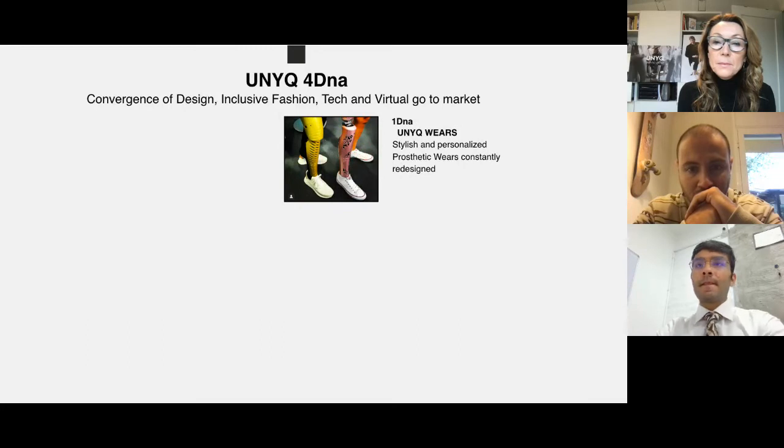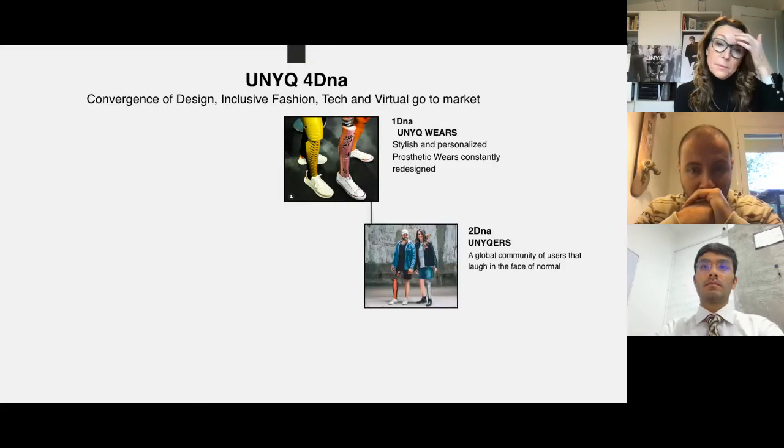And so we started with these covers, which we were able to make much cheaper than before, because the printers that we use for this have come down in price a lot, going from $5,000 down to more in the range of 1,000 and below, which is much more in the range of what insurance companies, at least in Europe and in the US, can afford. I know it's not where insurance companies are in other countries like India, but I'm very hopeful that we are steering in that direction over time.